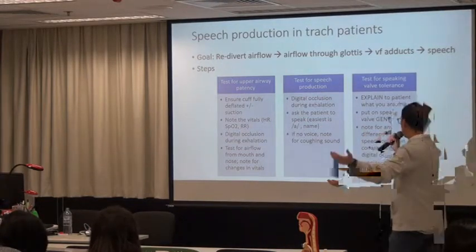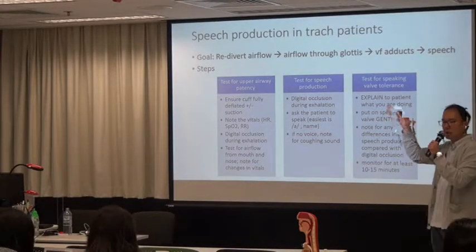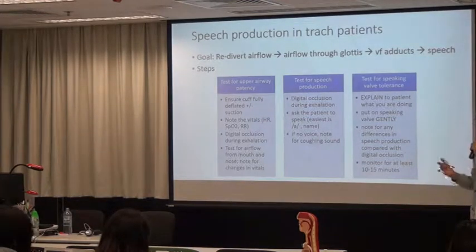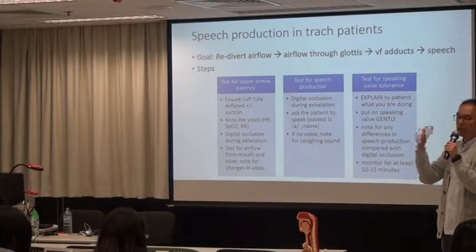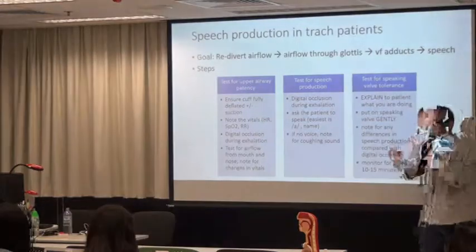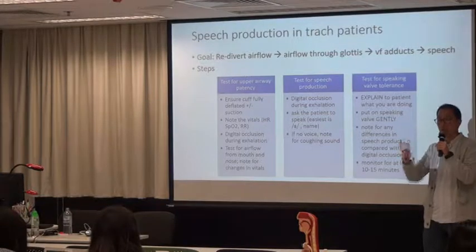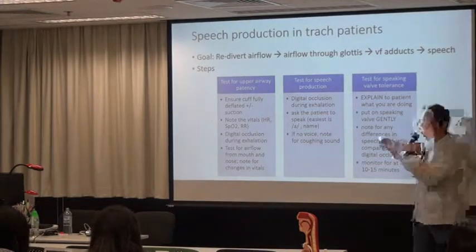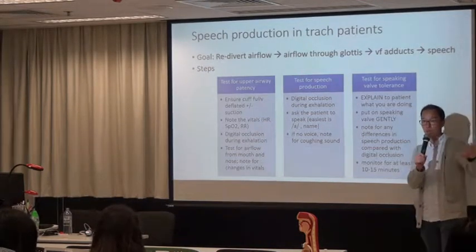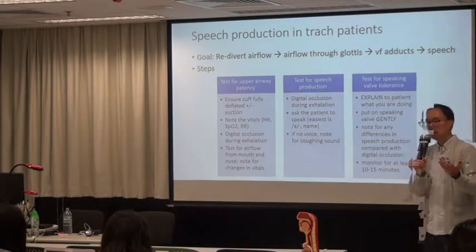OK， 如果你頭先嗰位同學咁樣咧，咁就真係會咳死啦，跟住個 patient 就會紅晒啦，跟住佢啲 vitals 就會跌啦咁樣。OK，咁 then what you do is you look for any differences after putting it on, as compared to digital occlusion. OK， so this previous step 有啲情況底下會嘅可能個 valve fit 得唔啱啦或者咧可能你擺嘅時候喐咗條喉啦，都有機會嘅。不過呢個情況比較少發生嘅。OK， 然後 don't just go。OK， 李先生你講到嘢啦喎，咁我哋下次再見啦，拜拜。咁咧就 it will be really bad.